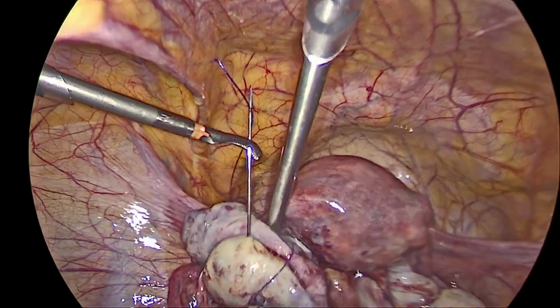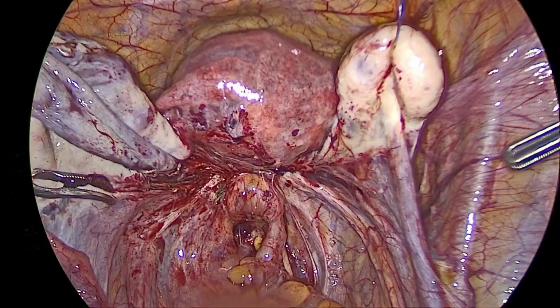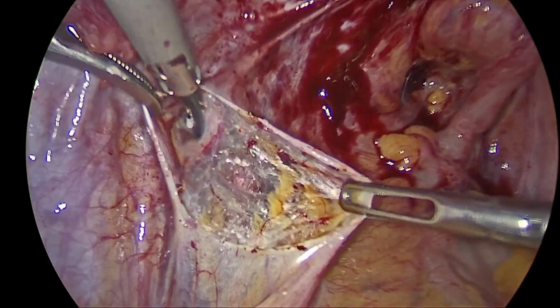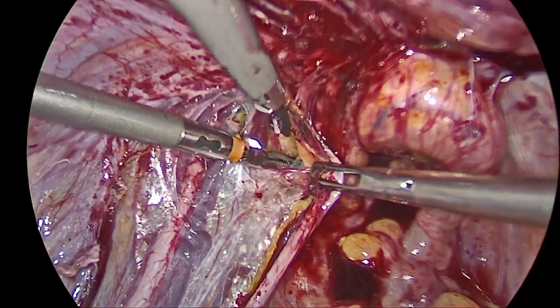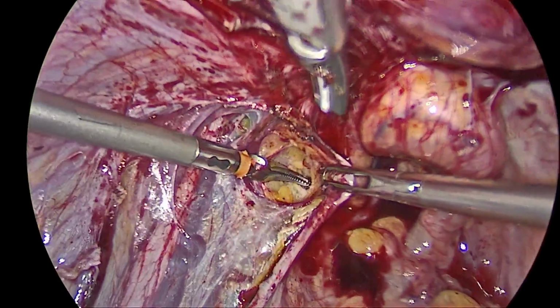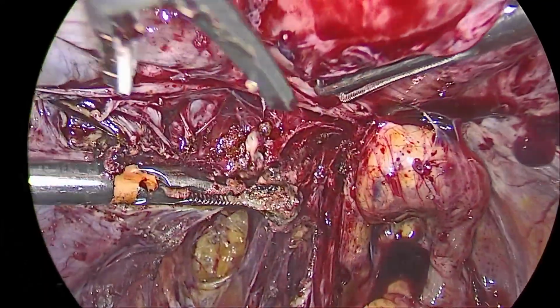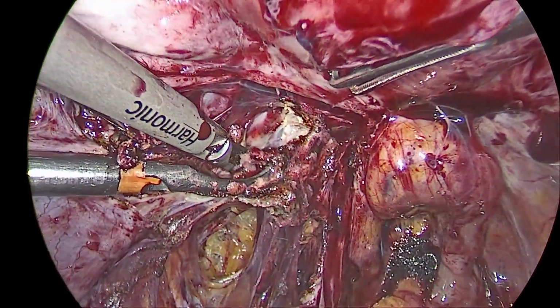Ovaries can be pexied temporarily to the anterior abdominal wall using a suture on a straight needle to optimize exposure. A bilateral ureterolysis is necessary in order to prevent distal ureteric injury at the time of stapler applications. An attempt should be made at lateralizing the hypogastric nerve. When present, uterosacral ligament or parametrial lesions can be excised at this step.